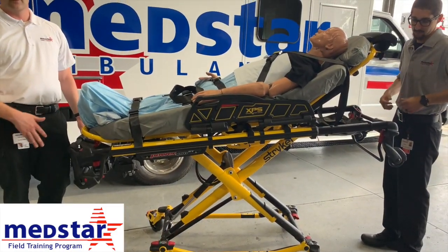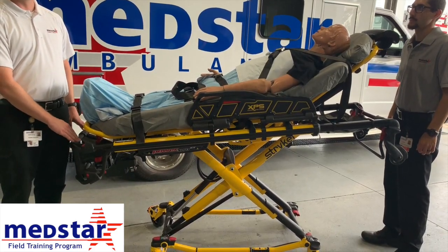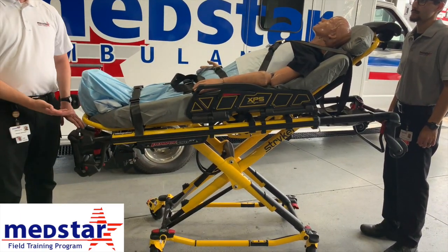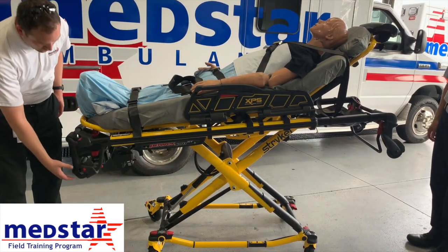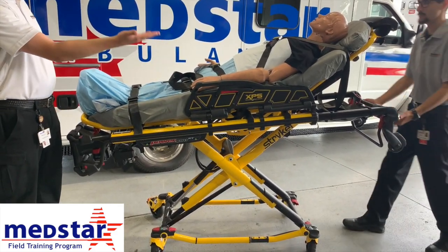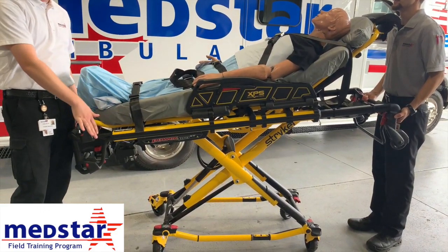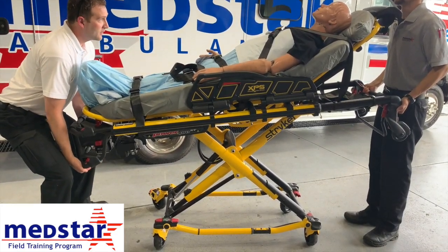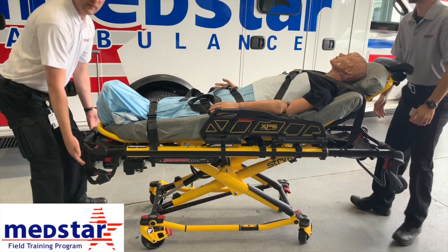The last thing to cover is how to do the manual release. In the event the stretcher battery dies or fails, there is a manual release mode for the Power Stryker stretcher — it is still operational without power. There is a failsafe: as long as there's weight on the stretcher, squeezing the manual release trigger will not release it manually. You need somebody at the back end to take the weight off, just like a regular manual stretcher, so you can't accidentally drop the patient. With good back safety — straight back, bent knees — lift up on the back, take pressure off, squeeze the trigger, then lower it down and let go.